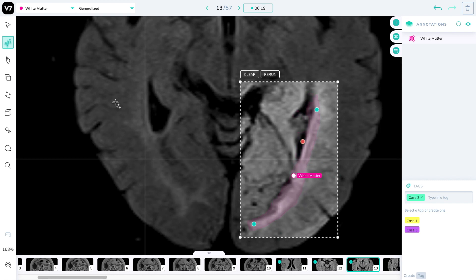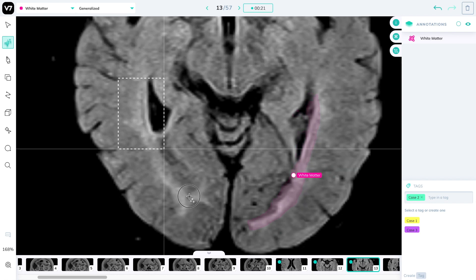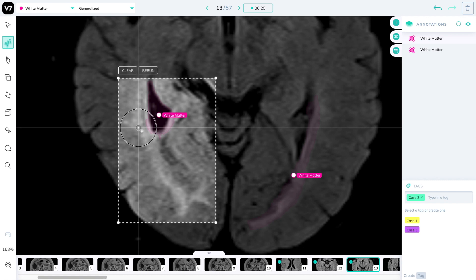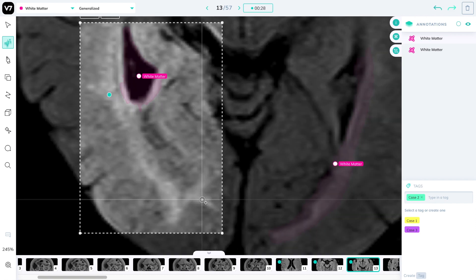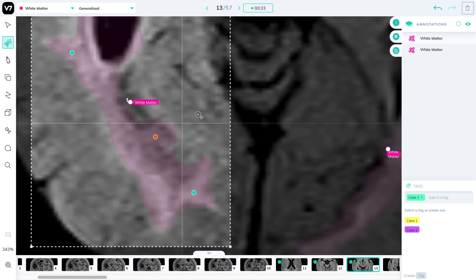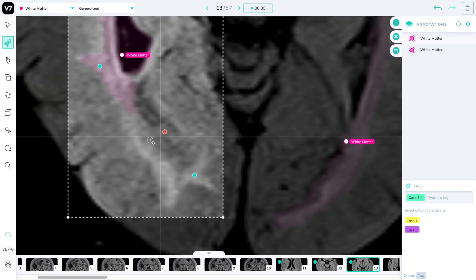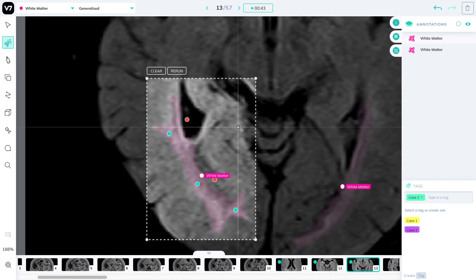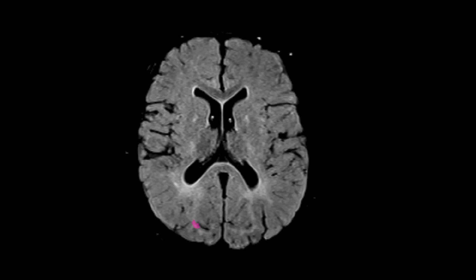We'll continue the annotation of these white matter lesions and watch as Darwin adapts to understand them. We can click outside the polygon to include a new area and inside the polygon to exclude it with red markers. You can also click on the markers to remove them. All of this is done through a deep neural network designed to adapt to any object in the medical or non-medical world. This full segmentation took a couple of minutes to complete.